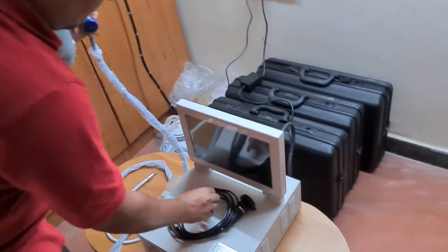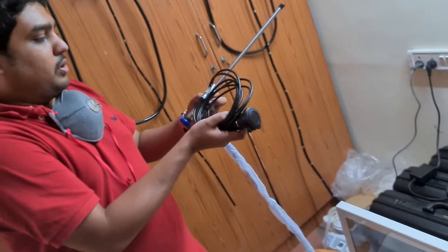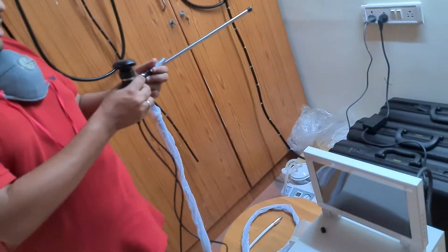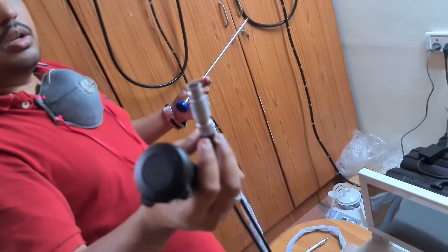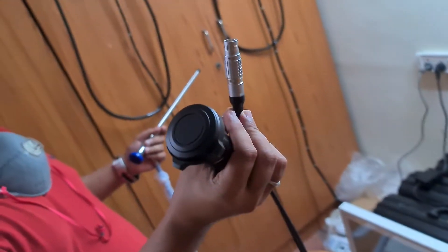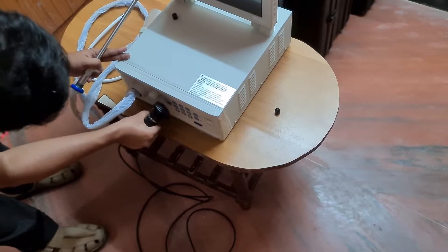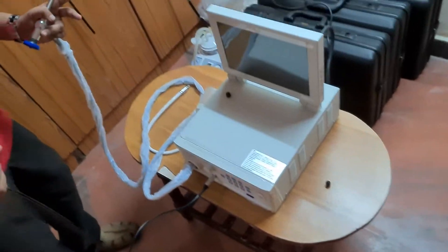Now we are going to connect the camera head. Previously, when we connected all the video scopes, we were using a signal cable connected to the scope. Here, you can see the signal cable is directly attached to the camera head. So the process is very simple — we are just going to connect this tip directly to the processor. As in our previous videos, make sure to see the red color marking, press it gently into the processor, align it, and give a small push.